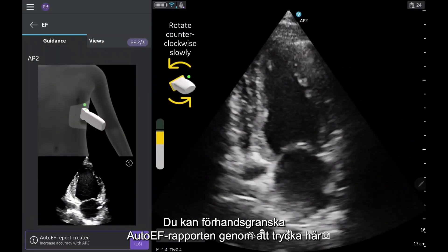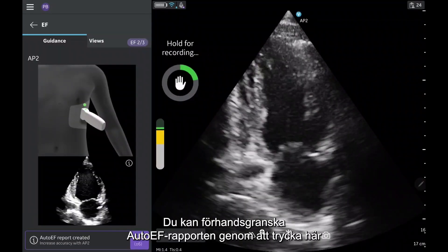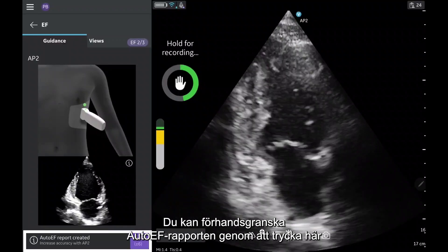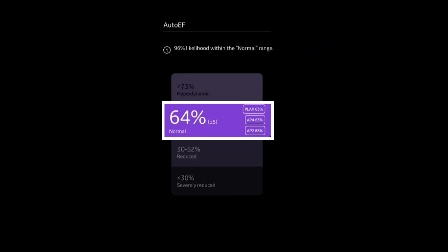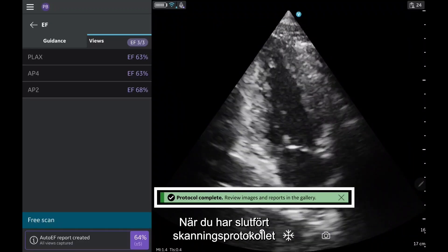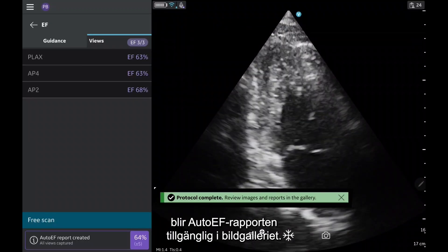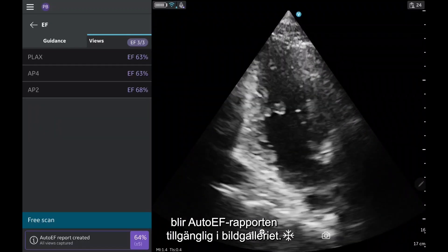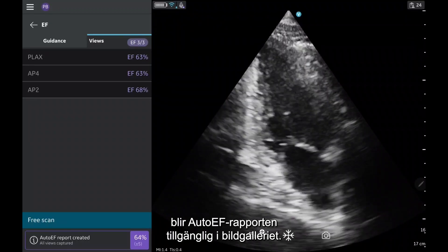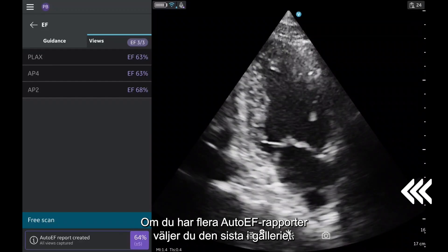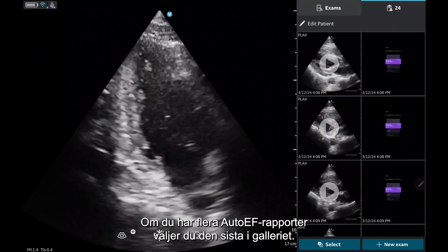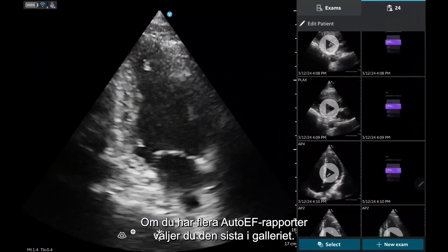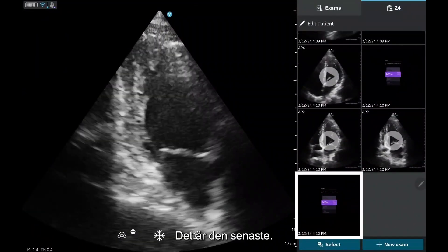During the exam, you can preview the auto-EF report by tapping here to see if the auto-EF falls within the normal range. Once you have completed your scanning protocol, an auto-EF report will be available in the image gallery. If you have multiple auto-EF reports, choose the last one in the gallery, as this will be the most recent.